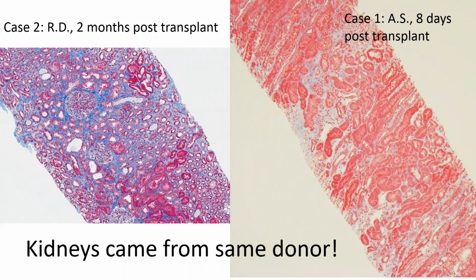Is there any chance you still have frozen tissue? You know, we might. We don't throw anything away. I think that would be a really useful study. Oh, yeah, that's a good point. Okay, so your position would be that if we were to perform IF on that transplant and we saw C3 staining in a similar pattern, we could say, hey, this is probably not really anything bad. This is just a condition of the kidney. Well, it helps. I wouldn't say that, but it helps with your inference. But if you saw nothing, that's where you really get a lot of help.